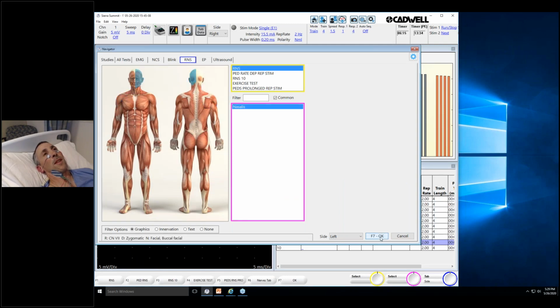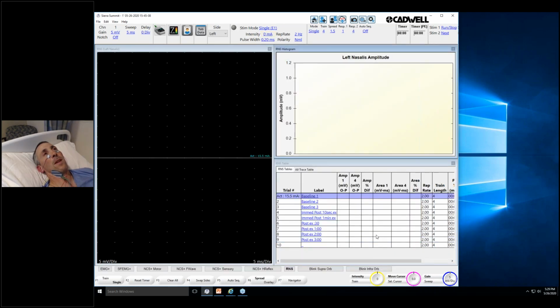One of the difficulties with this is that in many people, especially older patients, the amplitude's low. For the facial, we record nasalis; you can record over orbicularis oculi, but it's a low amplitude and there is often movement. You can't stabilize this muscle. So there may be some baseline sway that makes it a little more challenging to interpret mild decrement. So we're going to stimulate the nerve around the earlobe.